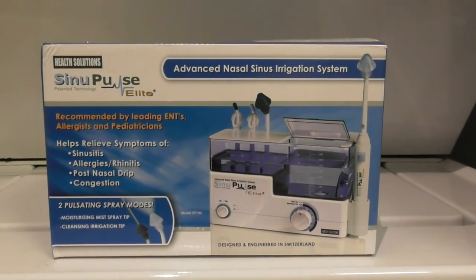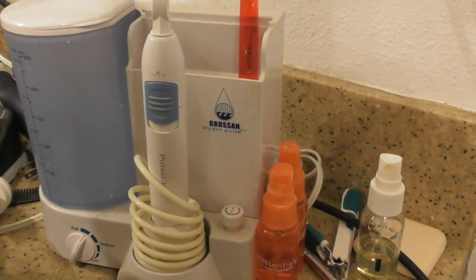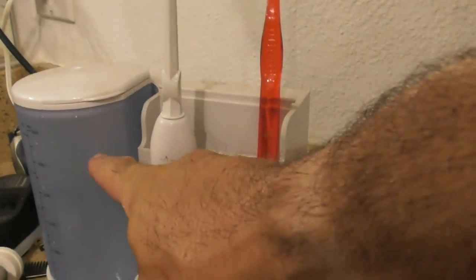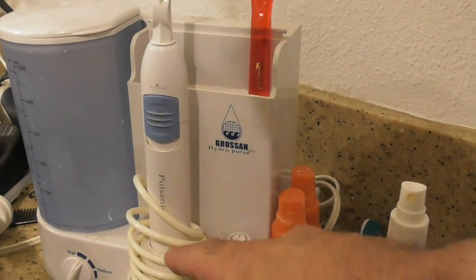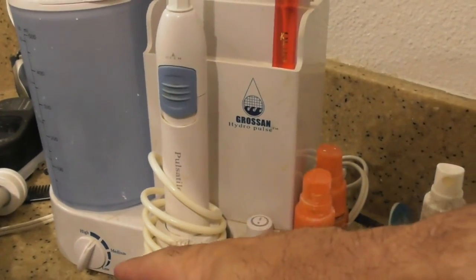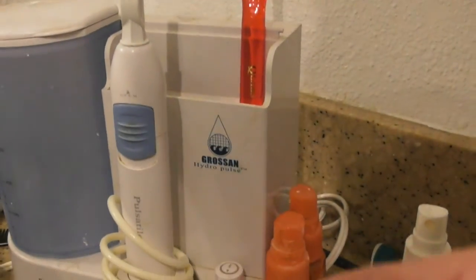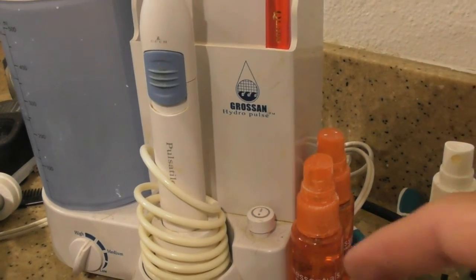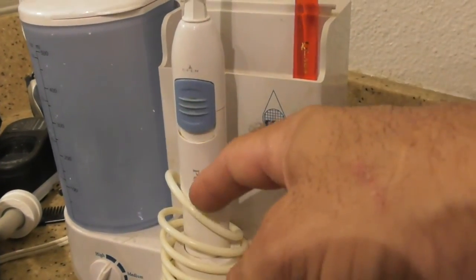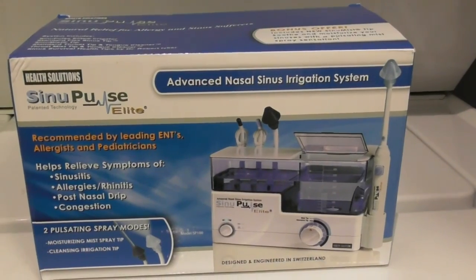I'll just call them hairs — there's a technical name but we'll go with that. I've been using the Grossan unit for maybe 10 years. These things really aren't supposed to last a long time but it's paid for itself. You fill it up with the solution, turn it on, press the on/off switch to control liquid flow, and use a dial to control the pressure and pulsing. It's done very well for me, though the saltwater solution sometimes jams it. So I decided to buy a newer model from Health Solutions — the SinuPulse Elite.